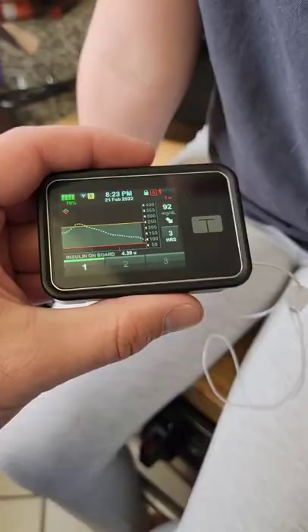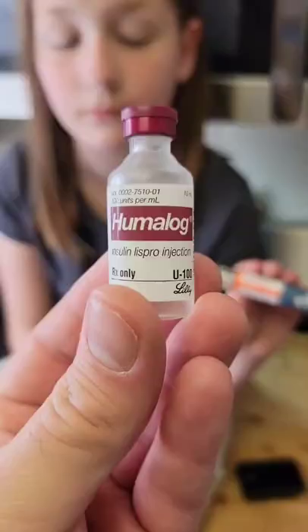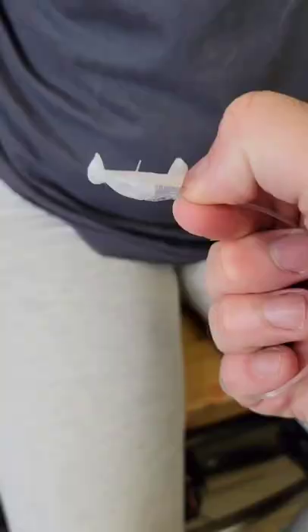Lillian is a diet badass. This is her insulin pump, and since it's on empty, we need to refill it. Our current stock has vials of Humalog or pens from when she was taking injections.